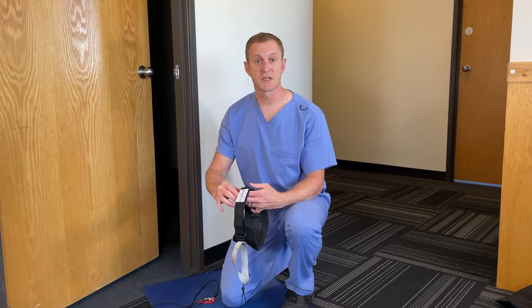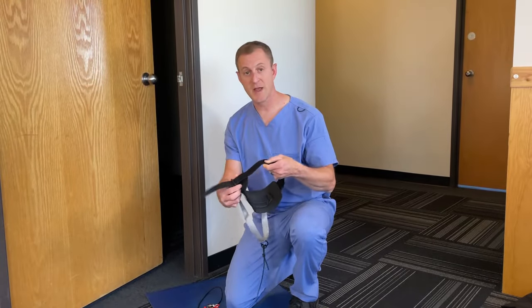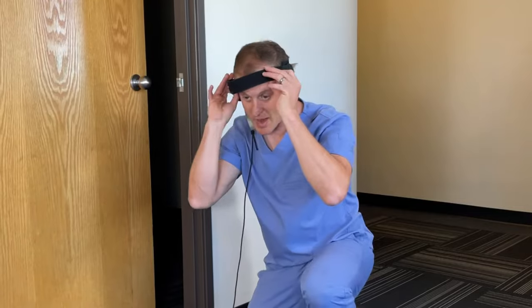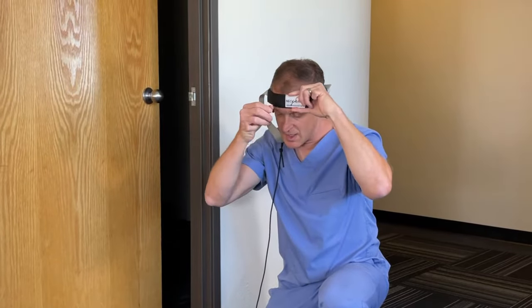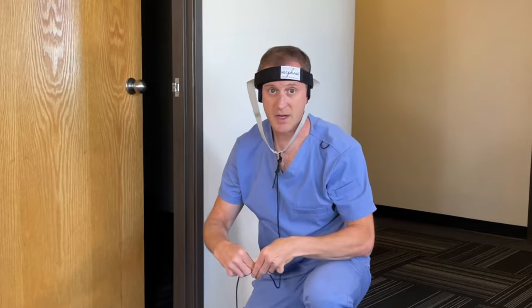Okay, let's get started with a session of decompression. Take NeckEase and open up the head strap. Position the device on your head with the shark skin neoprene at the back of your skull, and close down the head strap — not too tight, but just snug enough to get started. We're going to tighten it up later.